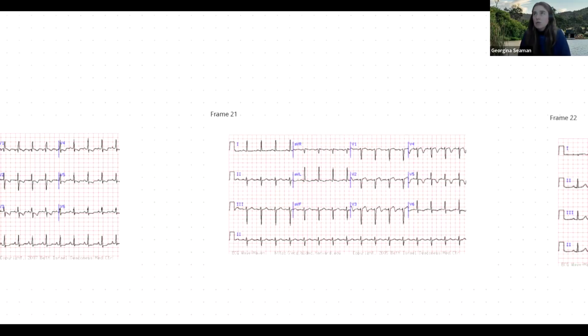And then I think at the end there's 2 or 3 12-lead ECGs, and it would be great if we could start to go through the steps that are on Milo. So your rate, your regularity, etc., going on from your 5 steps to your 10 steps to start to apply some of the things that we've talked about today, and also your ST segments and your T waves evaluations as well. Does that sort of summarize the homework for this week? Yep. Anita and I might even try and do a little mini recording and go through some examples of it so that we're explaining it later in the week if we get time. Yeah, go for it.